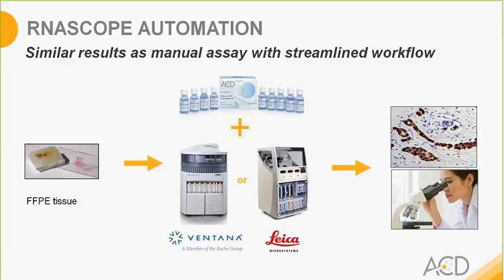Overall, automation has the potential to not only save hands-on time for operators and laboratories, but also to provide for greater reproducibility in RNAscope assay performance from day to day as well as operator to operator.